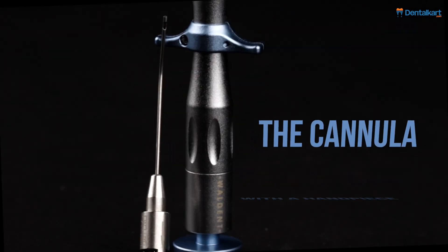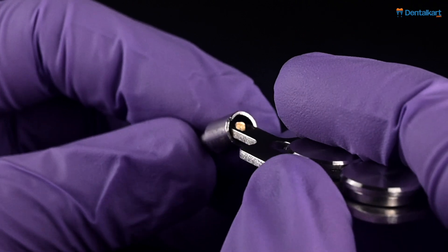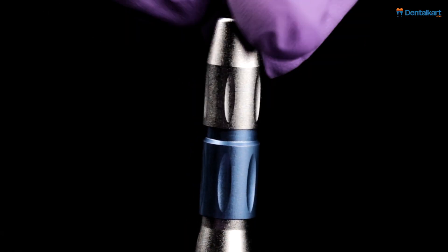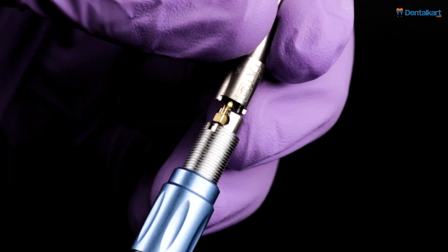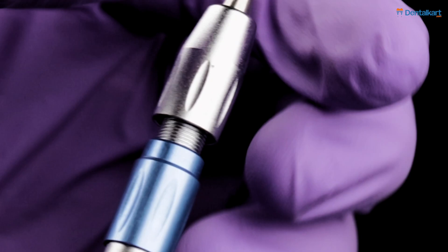To assemble the cannula with the handpiece: use a wrench to pull out the inner core head of the cannula. Remove the sleeve from the extractor handpiece, press the push cap, insert the inner core head and secure it. Then reattach the sleeve to the handpiece.